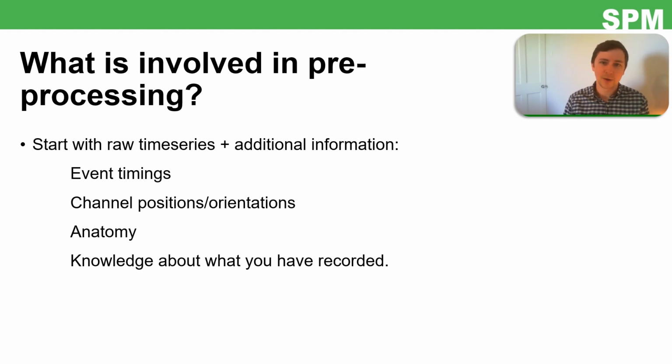And there's no one-size-fits-all standard pre-processing pipeline in EEG and MEG. Although I guess there are enough commonalities across recordings that there are a few standard principles which I'll raise as we go along.